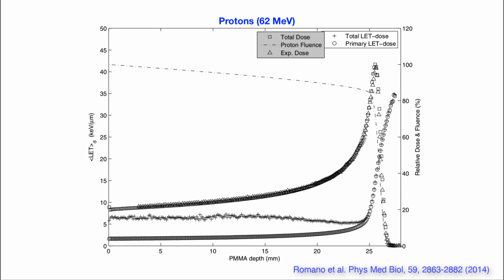There's the fluence of the beam of the protons, number of protons per centimeter squared per second, let's say. As you go down in depth, it reduces, the protons that are removed from the beam as they interact. Notice this is interesting. The fluence does not go down quasi-exponentially as it does in a photon beam. It's more linear until you get to the end.